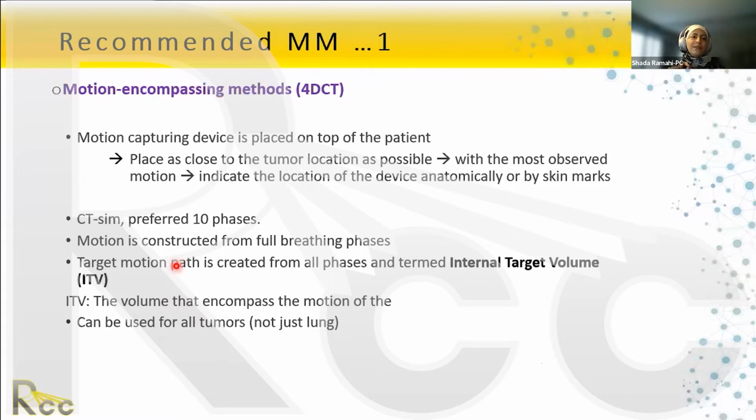So remember that the motion is not just up and down. It's not linear. Some tumors, especially in the lung, could go in either a circular motion or a more ellipsoid motion. So if I don't have enough sampling to capture the lateral and AP/PA motion, not just the superior-inferior, you could also be missing locations where the tumor might be. And I'll show you some examples where we have 6-8 millimeters in posterior and/or right-left motion.